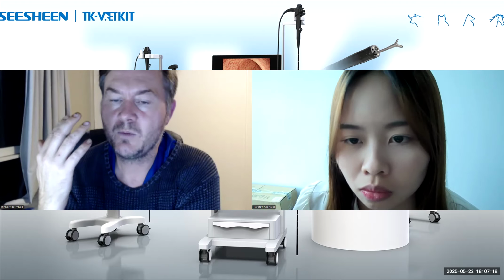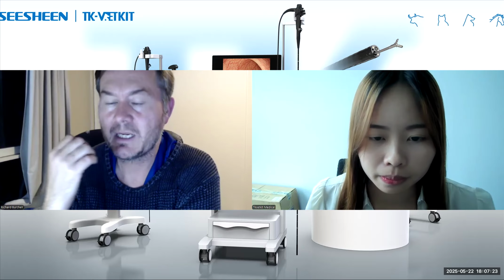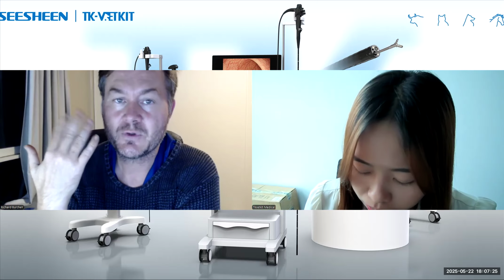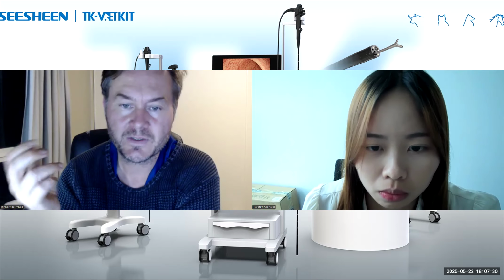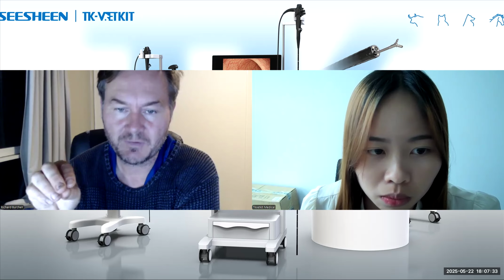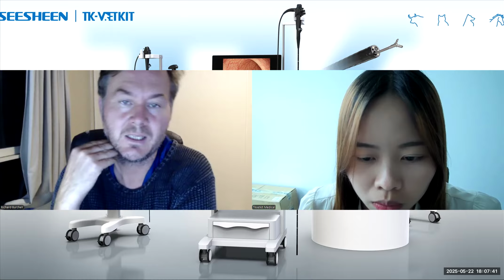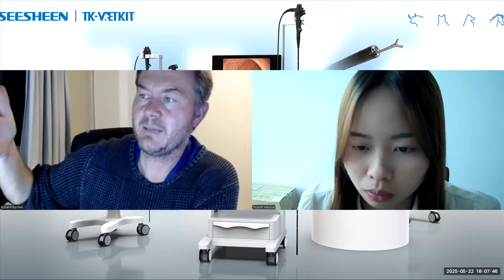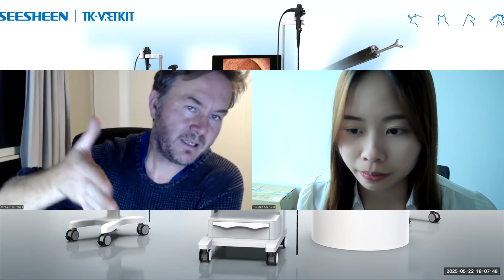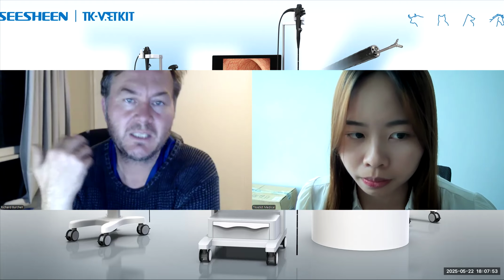And so we will try and evaluate their airway. We obviously use CT to evaluate their airway as well, but I like to evaluate their airway to identify aberrant turbinates, but also to identify sliding hiatal hernias. So I will put a scope into the esophagus, and then I'll occlude the ET tube and get them to breathe against some resistance to see whether there is a sliding hiatal hernia, because it gives you a good overview of the interplay between the respiratory system and the gastrointestinal system. So yeah, it's a very valuable tool.